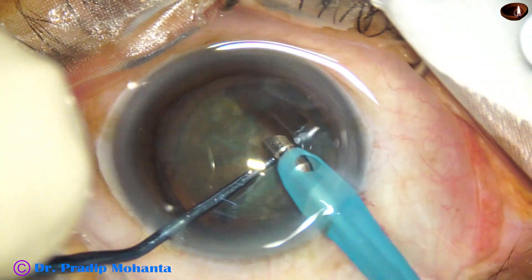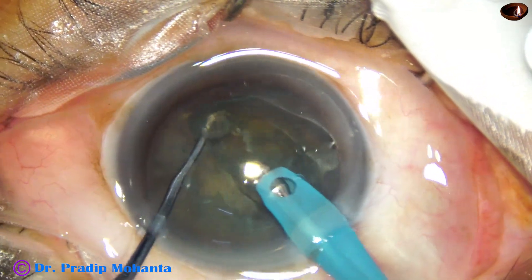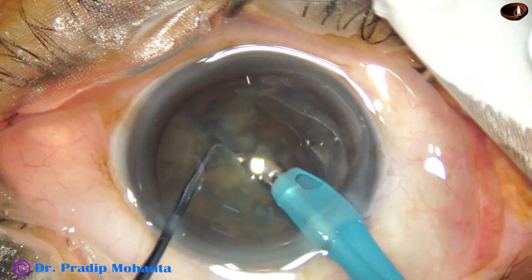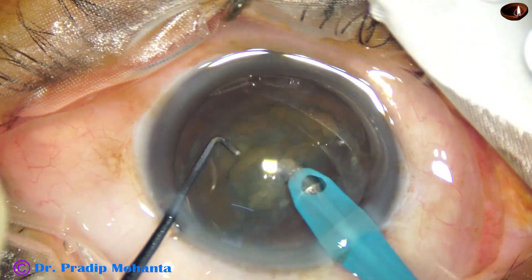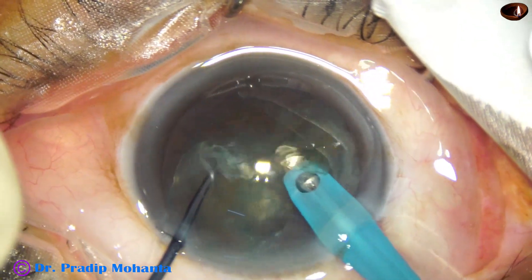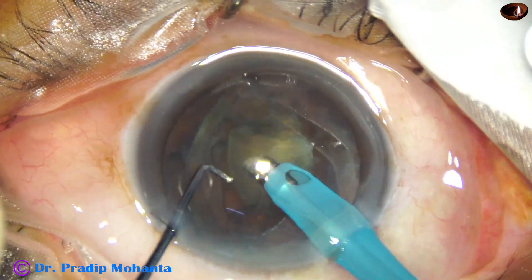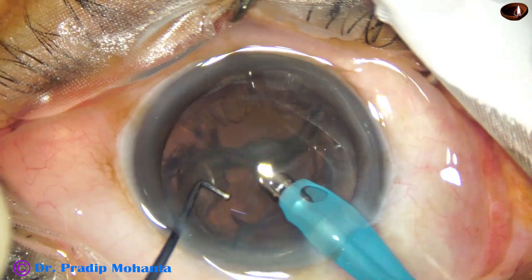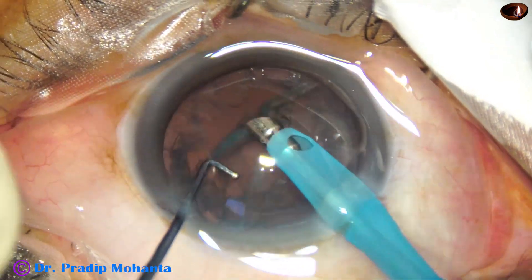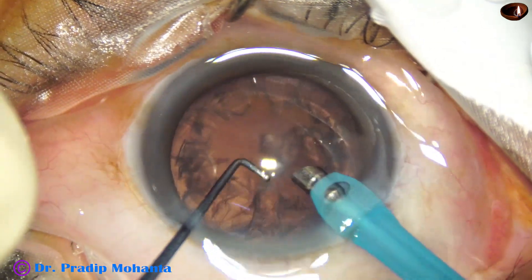The free nuclear fragment has been removed. This is the other free nuclear fragment — it comes out so easily. Now we just use this nucleus sustainer to divide the hemi-nucleus, and it can be divided easily. This is a totally unedited recording, and by this time — about 2 minutes and 20 seconds — we have come to this point.